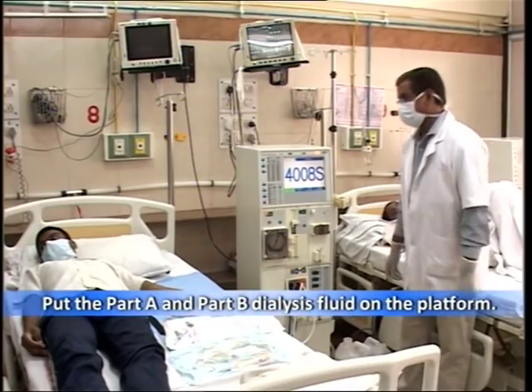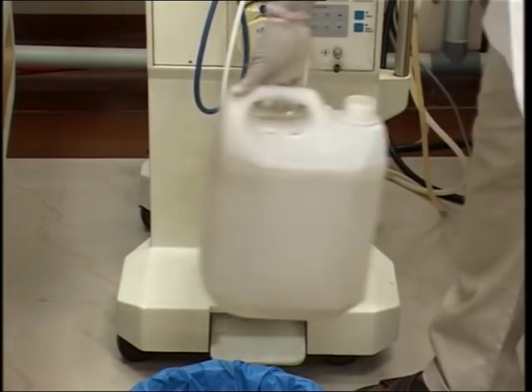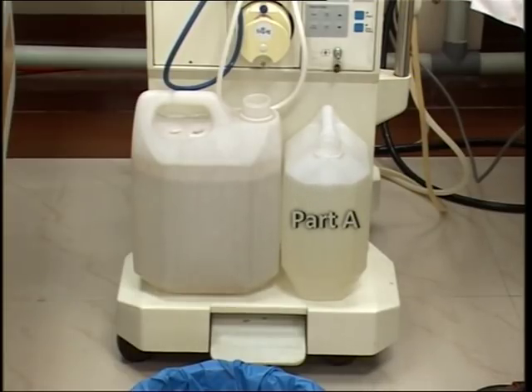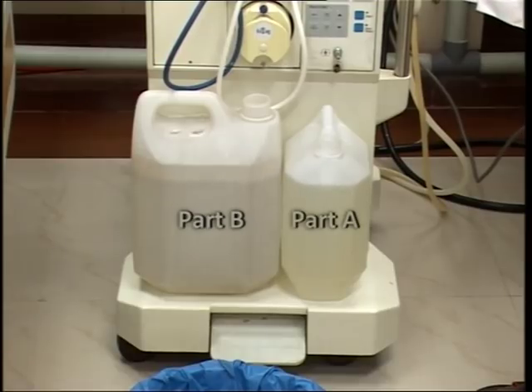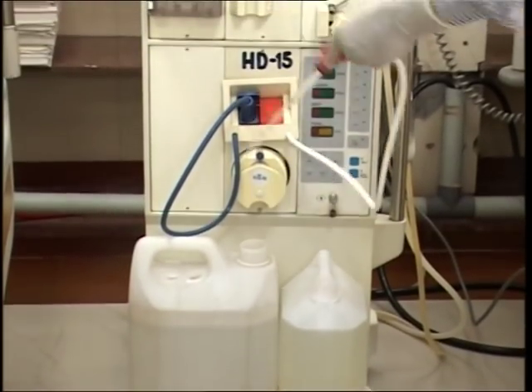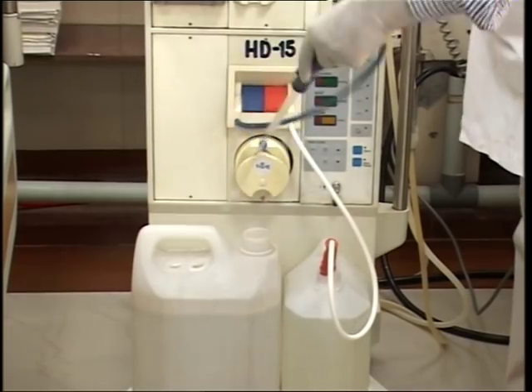Put the Part A dialysis fluid and Part B dialysis fluid on the platform provided on the dialysis machine. Part A consists of sodium, potassium, calcium, magnesium, and dextrose, while Part B usually consists of bicarbonate. Take out the Part A concentrate line and put it in the Part A solution. Then take out the Part B concentrate line and put it in the Part B solution.